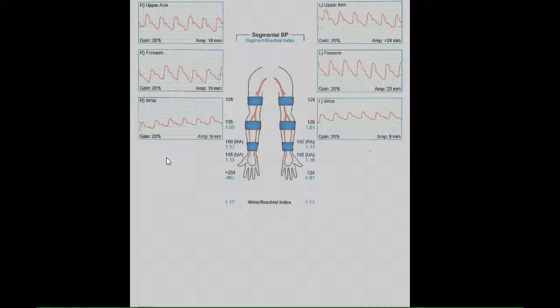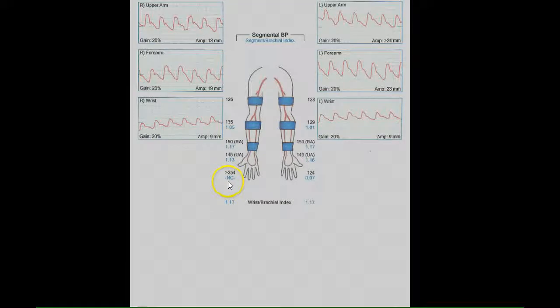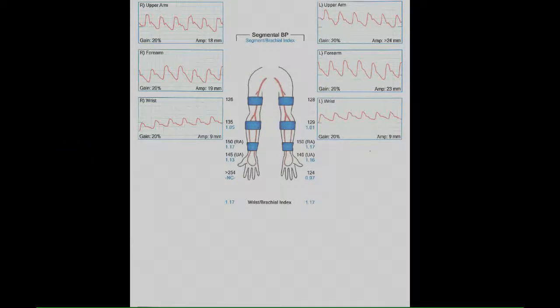Of note, the right digit pressure is not obtained as the vessels were not compressible. Aside from this, upper extremity flow is normal at rest.